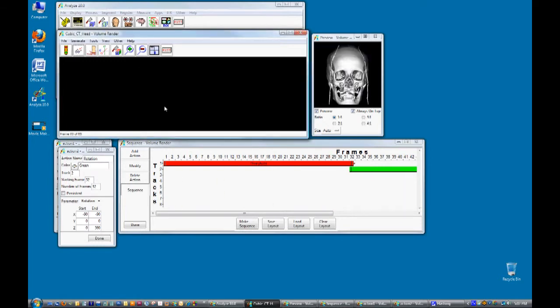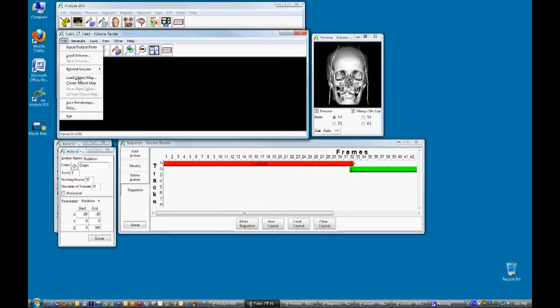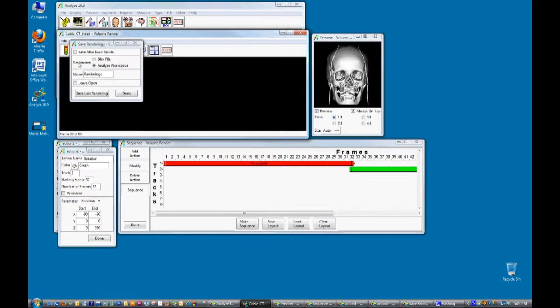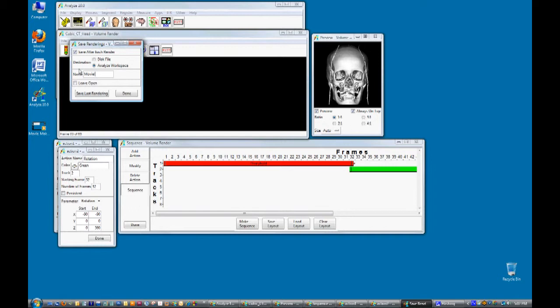To save this movie out to the analyze workspace select file, save renderings, and check the save after each render option. Name your movie and then click on the make sequence button.